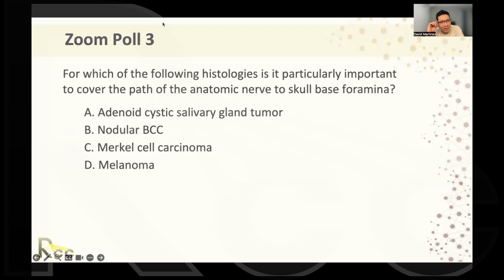Parag, Dr. Martinez, yeah. I have a question about if you make any difference between the focal or extensive perineural invasion on your CTV coverage. Great question. So if there's focal PNI and I don't see any other risk, so say it's a skin cancer, focal PNI, no other risk factors, I may just treat that with the resection bed with generous margin with electrons. But for that same skin cancer patient, if I see extensive PNI, then I am going to electively chase the nerve pathway to zone 1.